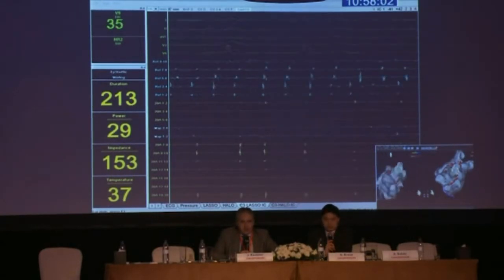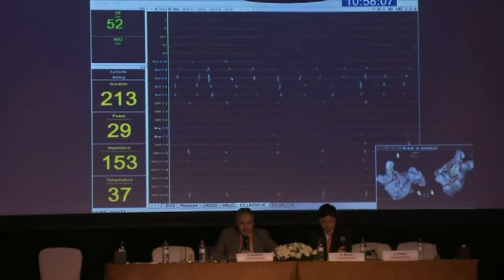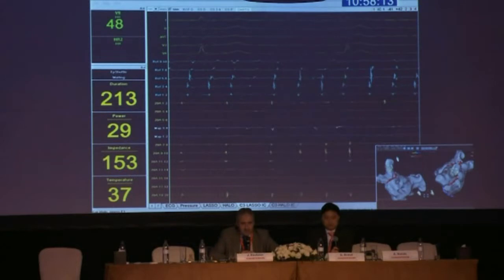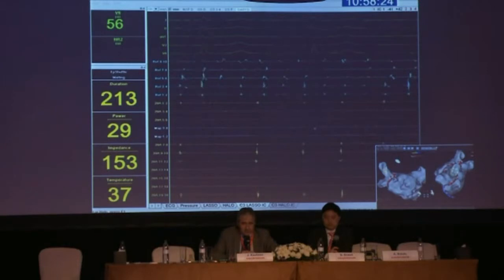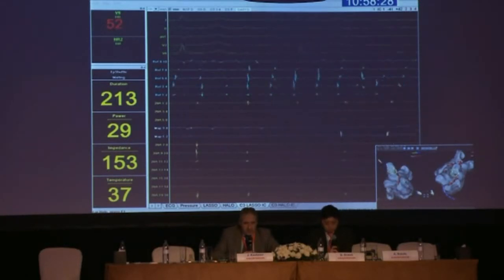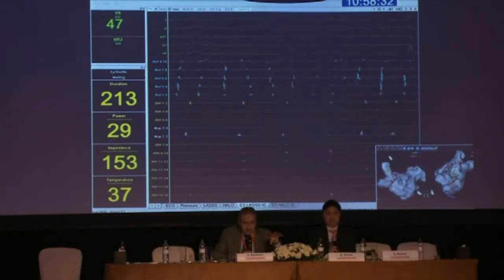So Richard, what are you doing? I see it's slowing down again in the superior vein. Yeah, so we've done what we would think would be a reasonable line. We've slowed it down quite a bit, and now I'm just moving my catheter around the inside of the line to try and gauge where the weak part of this line is. Can we see the bigger screen from Carto, please?